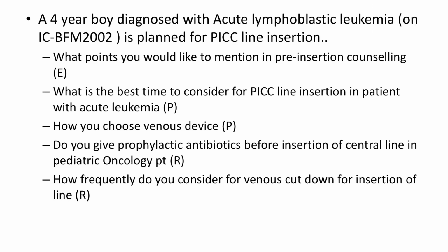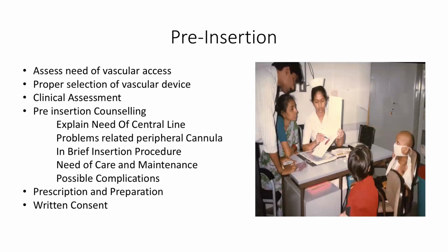Yes. Good evening, everyone. And thank you to Dr. Pankaj and Dr. Monica for inviting me to this webinar. We give pre-insertion counseling to all the patients who are going for port insertion or PICC or tunnel catheter, because we feel that counseling is very important for compliance with this care and maintenance. So in pre-insertion, we first assess the need of vascular access. We check the patient's veins. If the veins are good, we will go for PICC insertion. If it is not possible, then a port is inserted. On that depends how we select the device. Then we will do the clinical assessment.